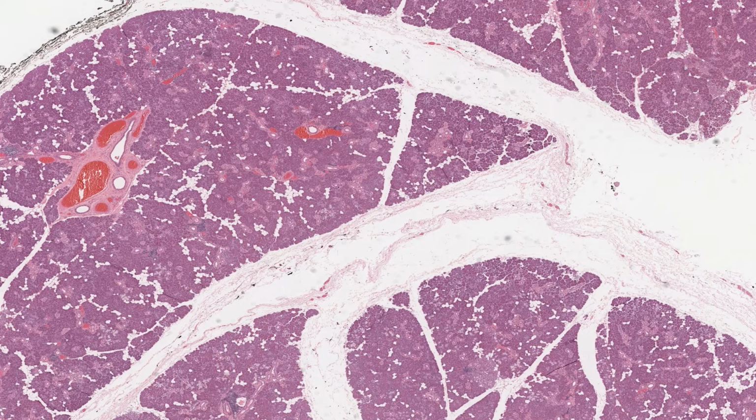The parotid gland is a branched tubulo-acinar or serous secreting gland. Its lobular divisions are clearly visible in this image, exaggerated by the shrinkage, and smaller lobules are bordered by many aggregates of roundish, clear spaces which are scattered fat cells. Fat cells happen to be characteristics of the parotid gland.